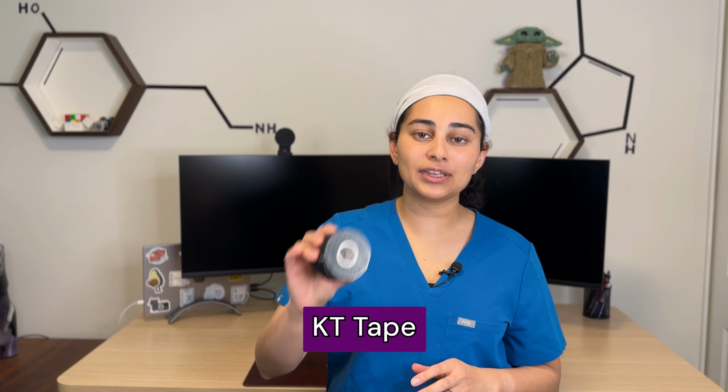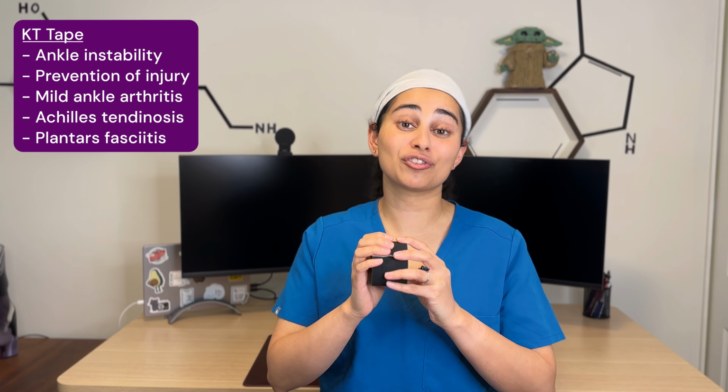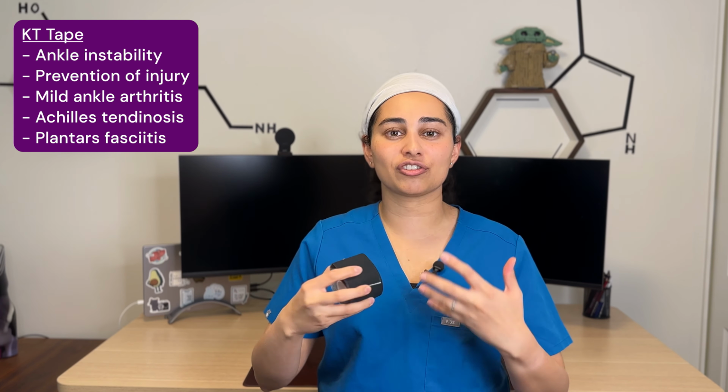And last but certainly not least, you can K-tape many of these areas that I showed you bracing for. In many cases, patients don't like the bulkiness of braces or don't need that added level of support. The nice thing is you can put this on and then put a shoe on. You can put this on and then you can compete with it. So this is always something to be aware of, and a good therapist can show you how to tape for the condition that you're experiencing.